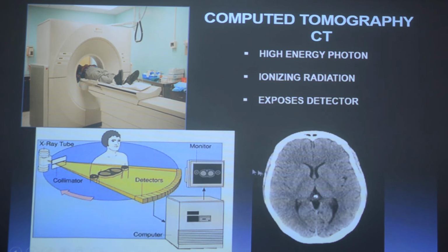Now what happens here is the X-rays are passing through the skull. If you have fluids, the majority of X-rays would be reaching the detector at that point. If they are passing through the brain, some would pass, some would be stopped. If it is bone, the majority would be stopped and some would still reach the detector. So the detectors around the brain would be able to detect different gray scales.